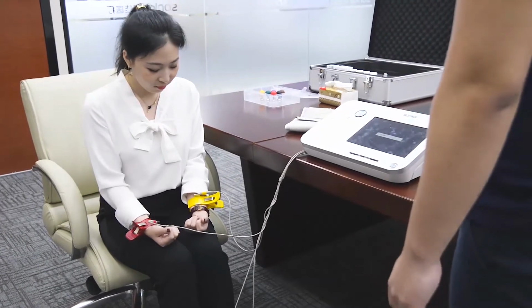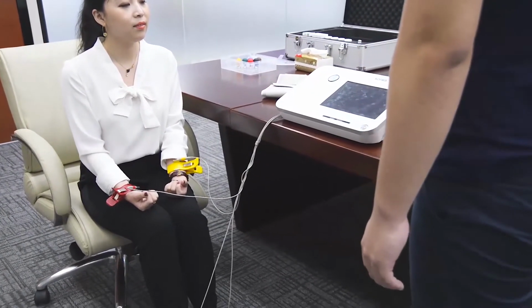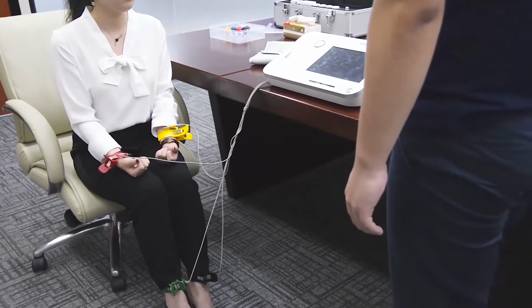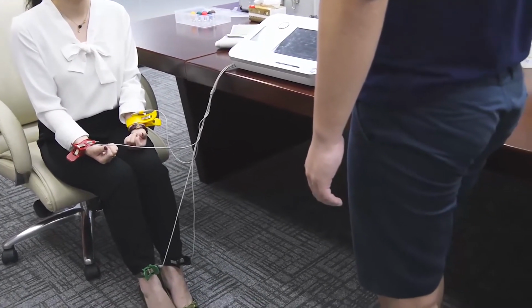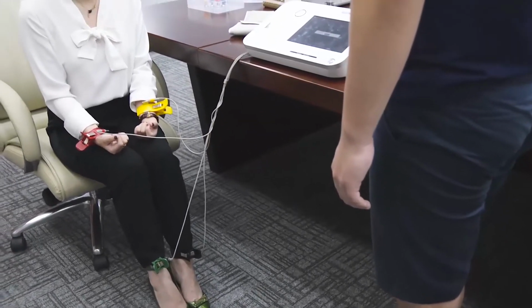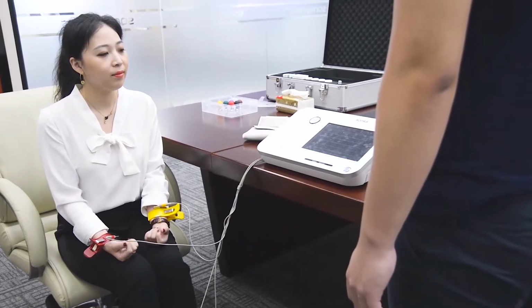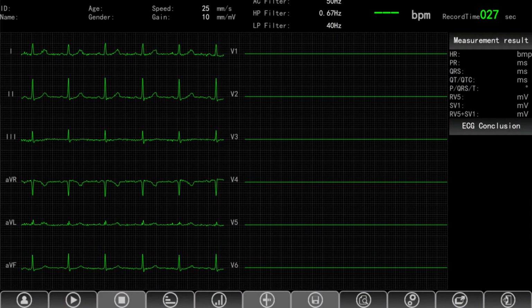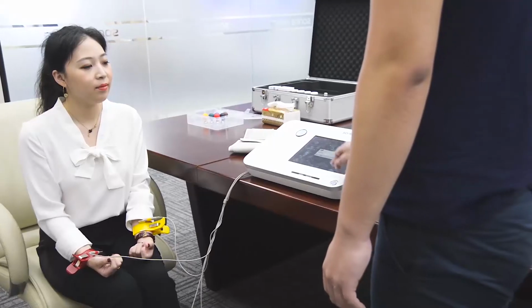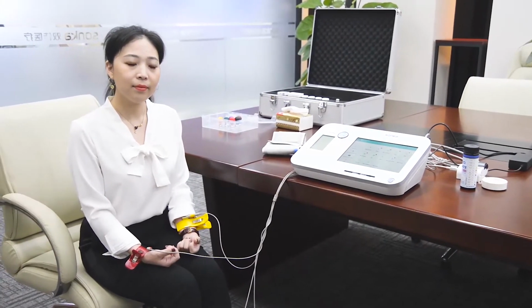Put your hands on your knee and keep silent. Okay, as you can see, the result is shown on the screen. Okay, we remove the clip, please.